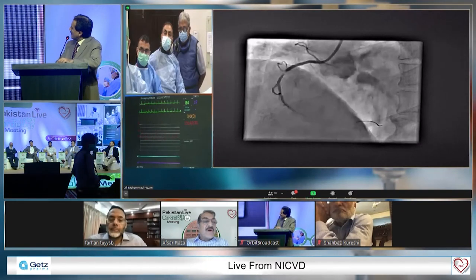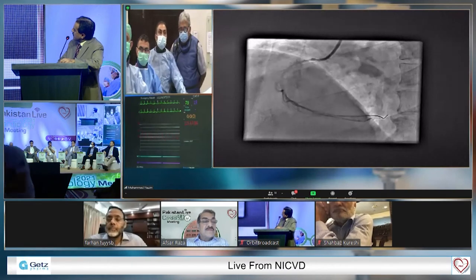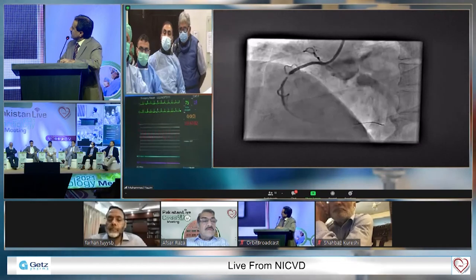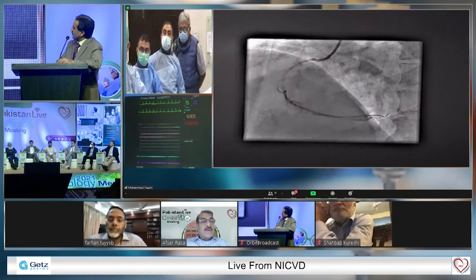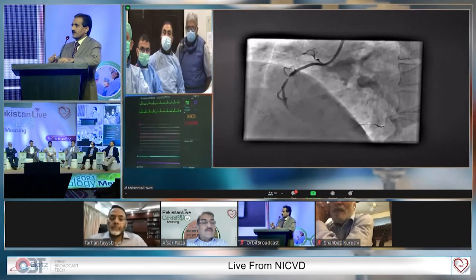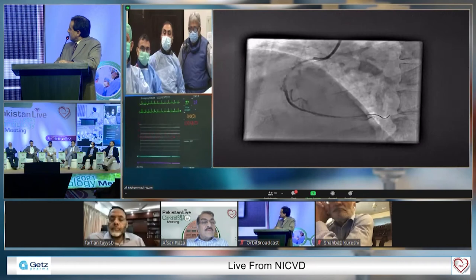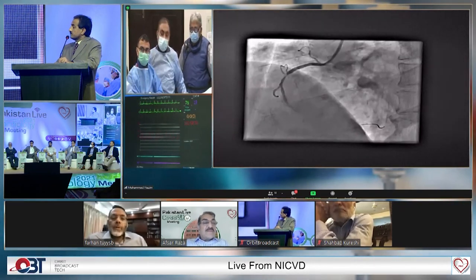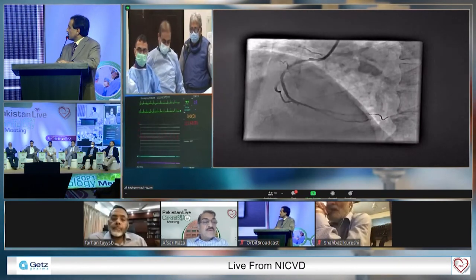But it depends on how we see. If the anatomy is clear, then I think pre-dilate with 2 millimeter or better. Yeah, I agree that primary stenting can be done, but in the acute MI setting we try to use the minimum, because longer stents mean more problems, so we try to use a smaller stent instead of a longer one if we can avoid it. But okay, go ahead, Naeem, tell us, because we have 5 minutes of transmission. Sometimes the problem with the shorter stent is that you miss the most distal area.